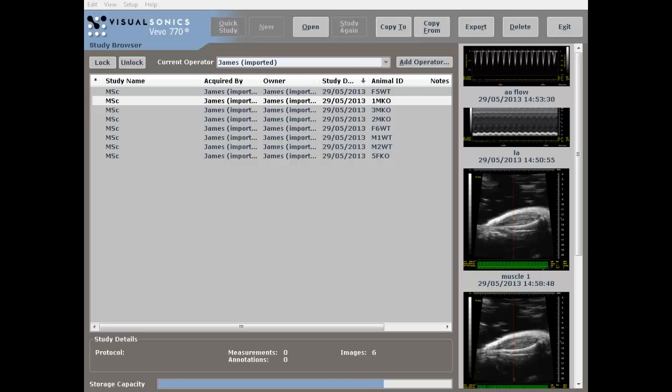Hi, so this is a quick whistle-stop tour through the one-dimensional echocardiographic measurements taken from murine or rat hearts using the VisualSonics VEVO770 high-resolution ultrasound system. This is a technology that allows high-resolution recording of ultrasound images from rodents with very high frequency and high sample accuracy. Of course, it's only as accurate as the measurements taken.